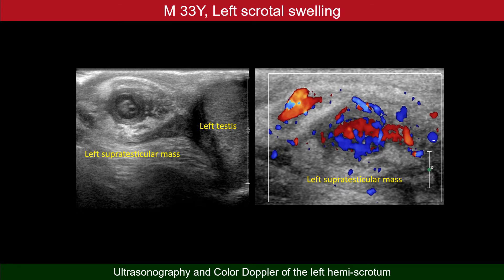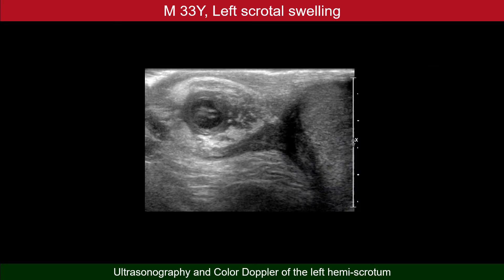Color on color Doppler sonography does not necessarily mean flow of blood. It is the Doppler shift caused by a moving structure — any moving structure. On this real-time grayscale ultrasonography, we'll see that the moving structures are in fact in the center of the lesion.